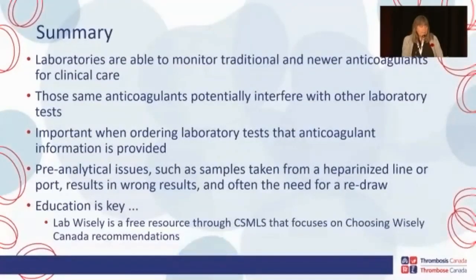So in summary, laboratories are able to monitor traditional and newer anticoagulants for clinical care. Those same anticoagulants potentially interfere with other lab tests. It's important when ordering lab tests that anticoagulant information is provided. And pre-analytical issues are the tip of the iceberg that we see, all right?